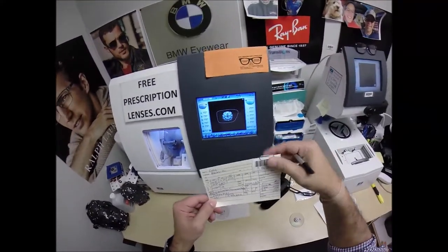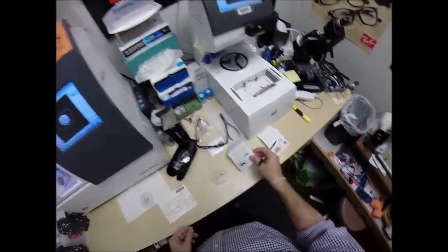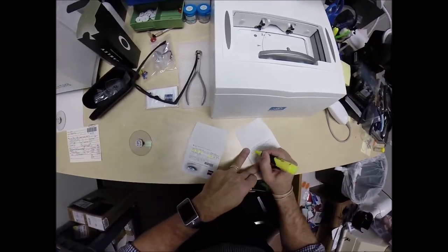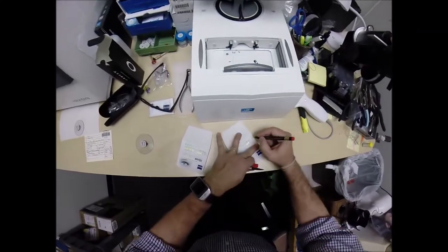You are secret agent 2157. It's always good when you can document everything. That's what I love about these lenses. Now, the left eye is just a plus 50 sphere. I'm going to mark this one L for left.